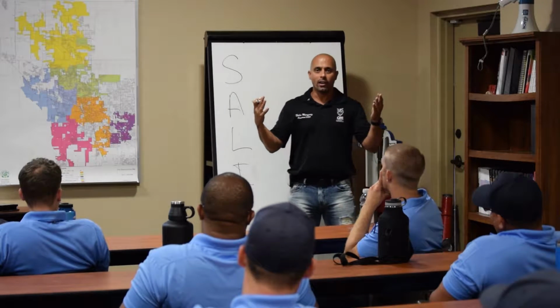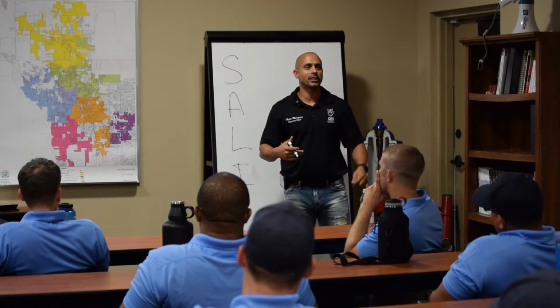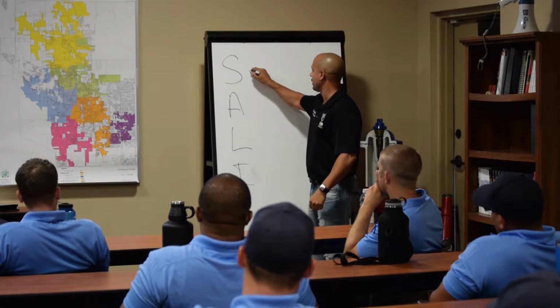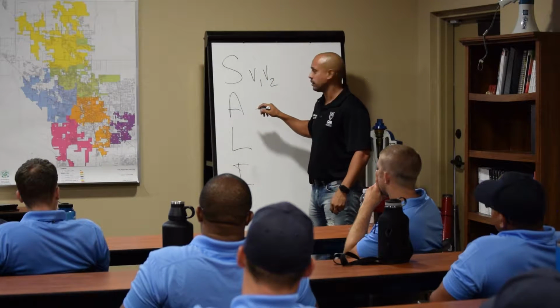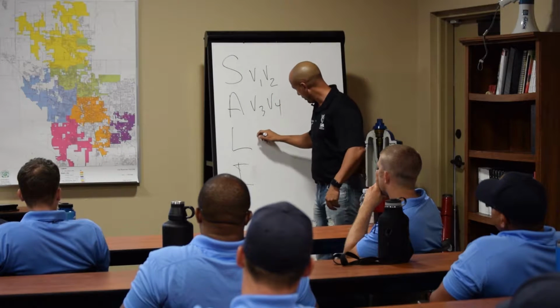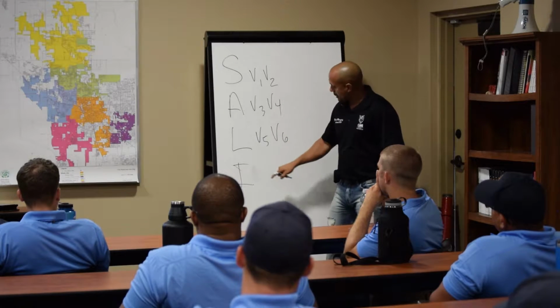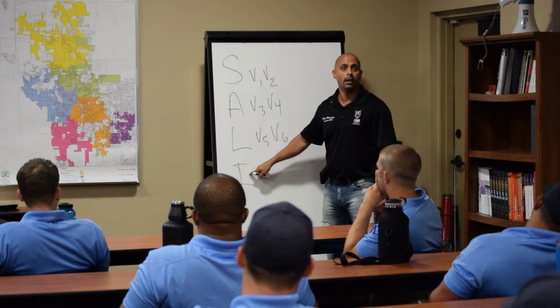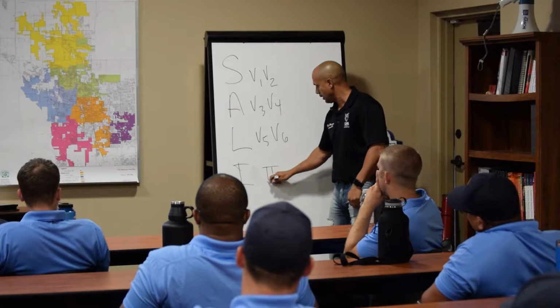What's the whole problem? The heart, right? Where's the heart sit? In the chest, right? So let's start with our chest leads. What's the first two chest leads? V1, V2. What comes after V2? V3, V4. What comes after V4? V5, V6. You with me so far? This looks like Roman numeral number what? What comes after Roman numeral number 1? Then?